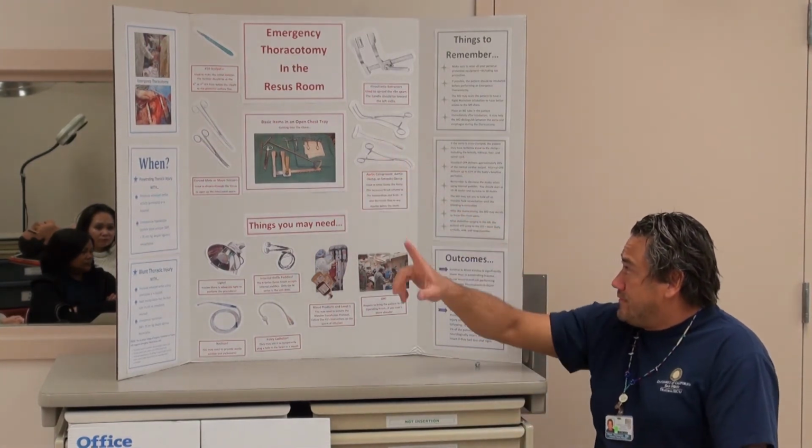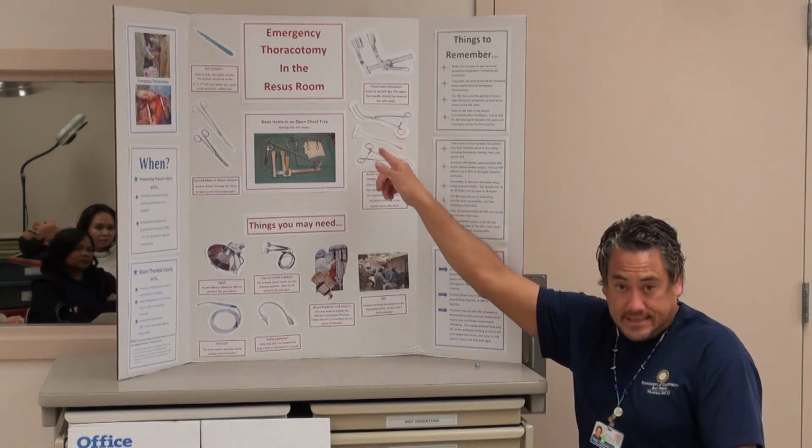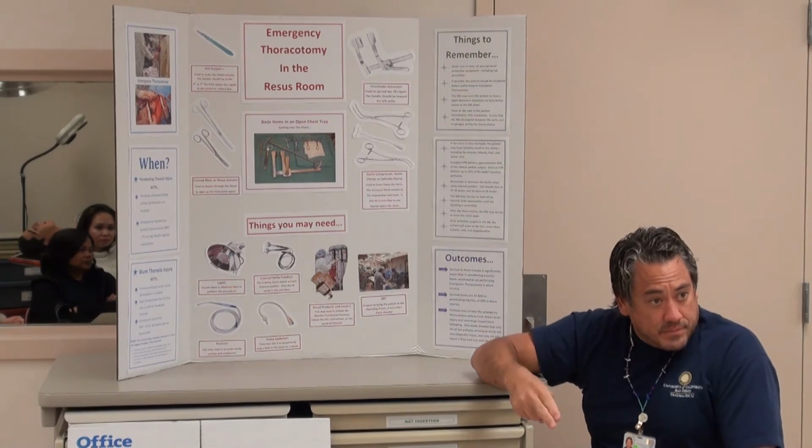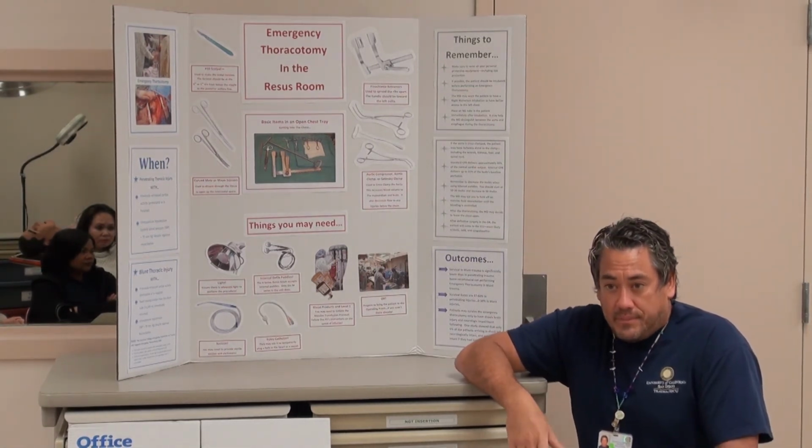This is a little compressor device. I don't think that they have this thing in our kits. I think that they just have these Satinsky clamps, and they'll just clamp the aorta. The doc should tell you when they're clamping the aorta.